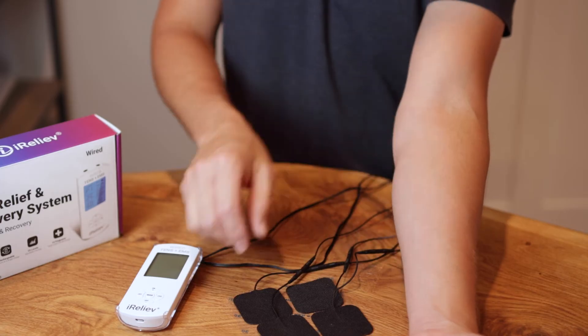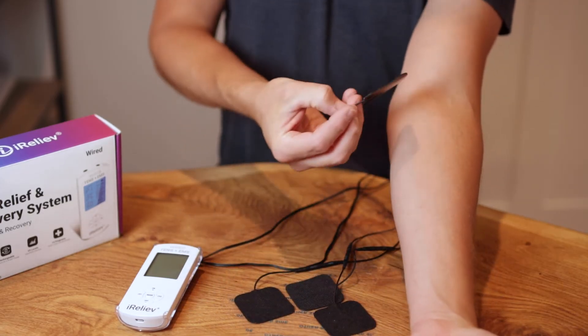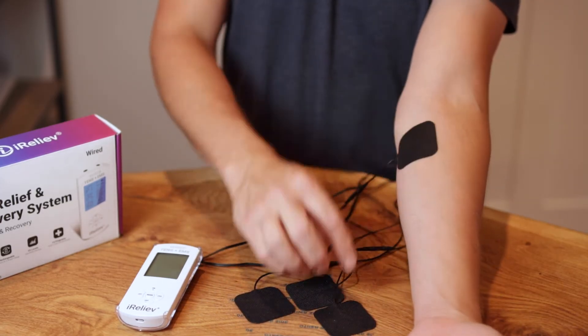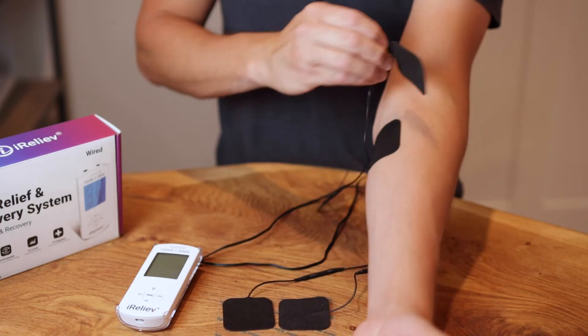Alright, let's talk about placing these pads. Step one is to make sure that your skin is clear of any lotions or oils so that this pad with a sticky back can stick to that skin very easily.